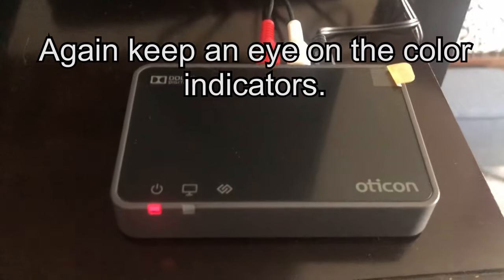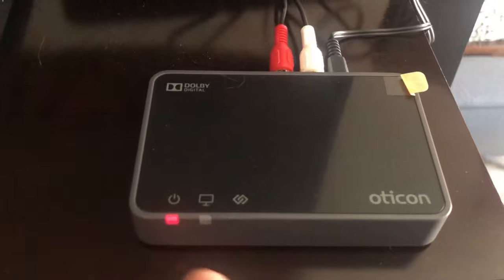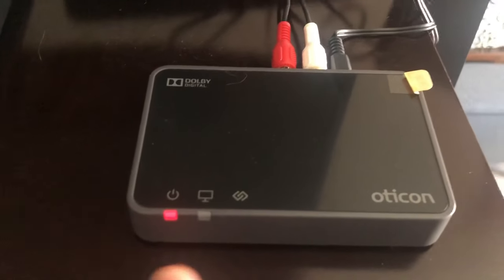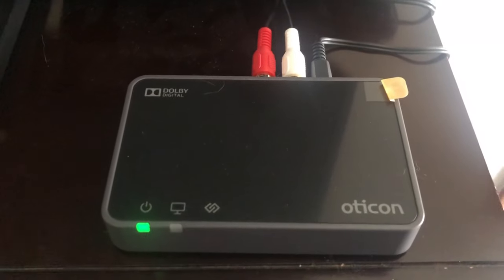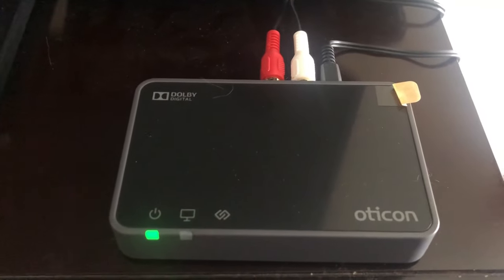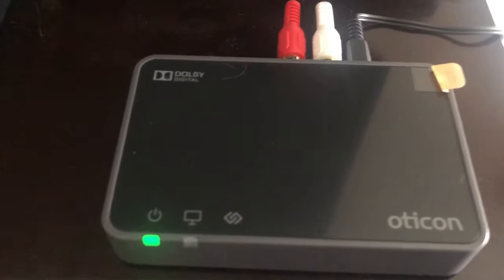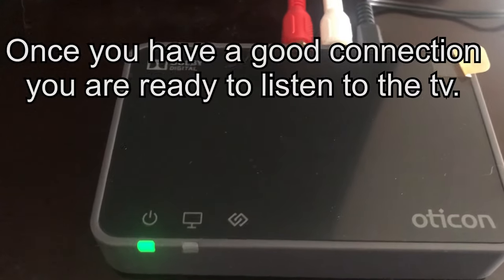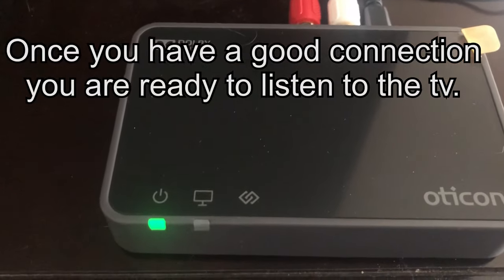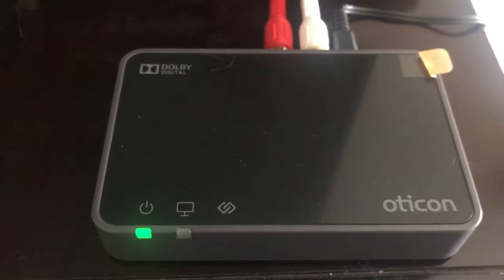After pairing the hearing aids and taking them off the box, the light showed red on one side and no color on the other. After referring to the user manual, I realized the red light meant it was powered on but not streaming. Now there are green lights, but a blinking green light, which means it's not streaming yet. Make sure your TV is hooked up, and if you see a specific color, refer to your user manual to know how to resolve those particular issues.